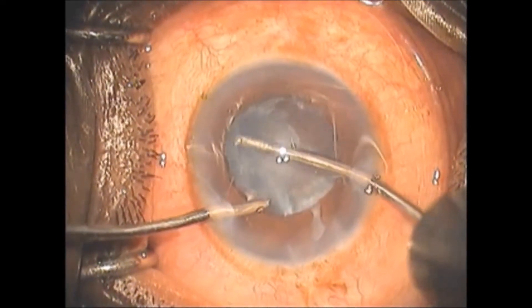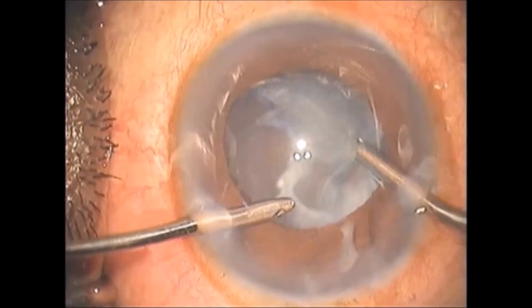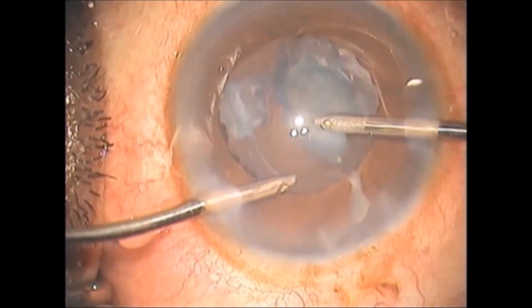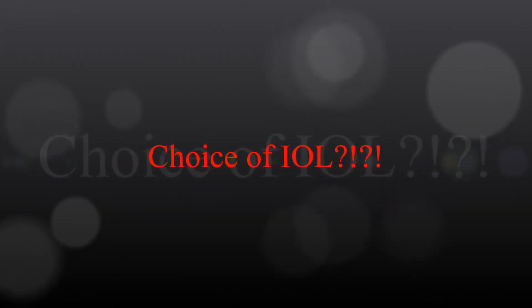Most mature cataracts have little or no cortical matter. The bi-manual cortex aspiration technique is best suited, as it provides better control and anterior chamber stability.